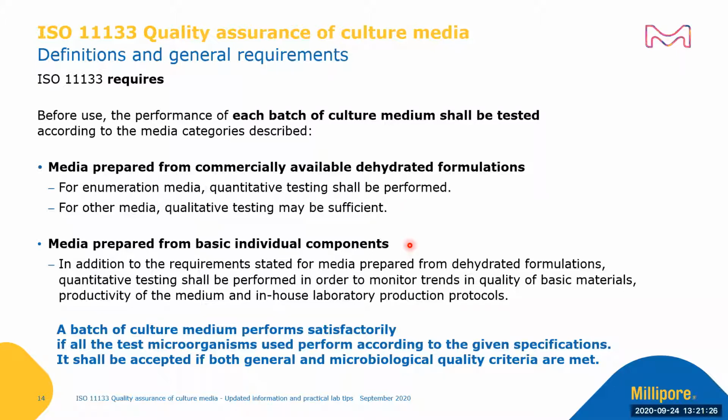And for each batch of media prepared from basic individual components, in addition to the requirements stated for media prepared from dehydrated formulations as given here, quantitative testing shall be performed in order to monitor trends in quality of basic materials, productivity of the medium, and in-house laboratory production protocols are required.